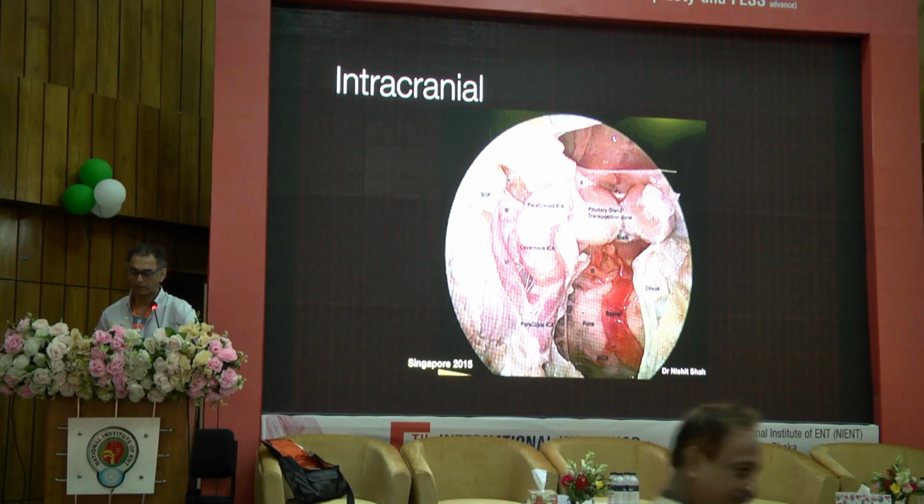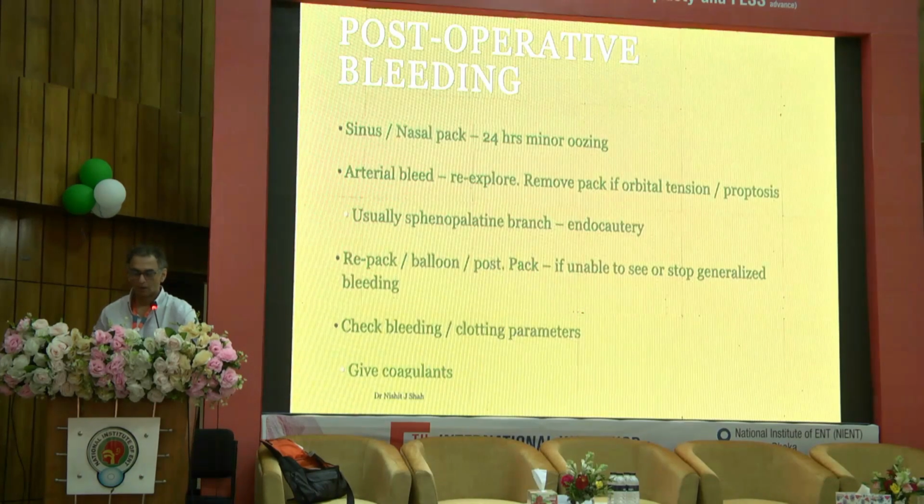Okay, post-op, what do you do if there's bleeding? You have to pack again if required. If it's an arterial bleed, please take the patient back to theatre, re-explore, and check bleeding clotting parameters.